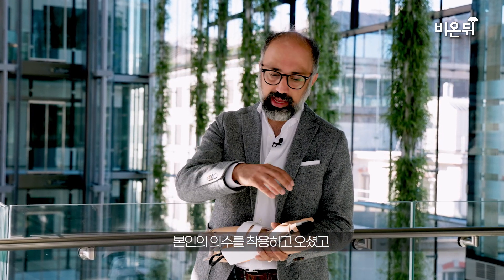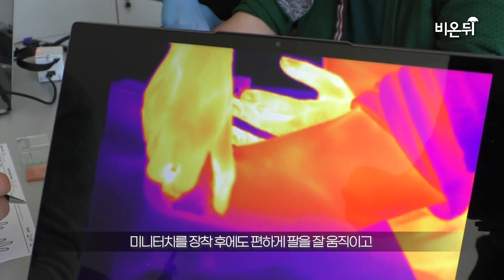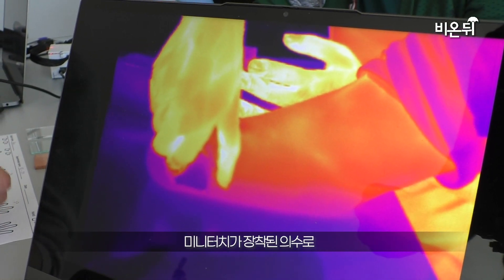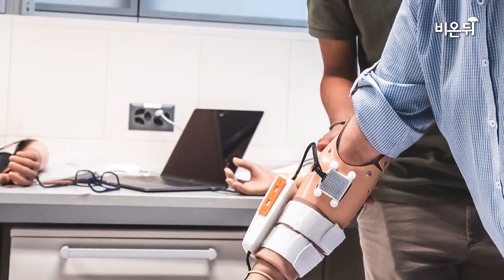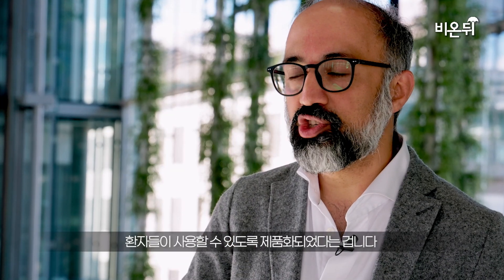For the study, we worked with Fabrizio, who's an arm amputee, who came with his own prosthetic and we equipped it with our system. Using this technology, he could seamlessly move his own arm, but even more importantly, detect if he was touching a human hand or a fake hand. This social part of touch is something that opens new perspectives. What is exciting is that the study shows the technology is mature enough to leave the lab and could now potentially enhance the life of patients using it.